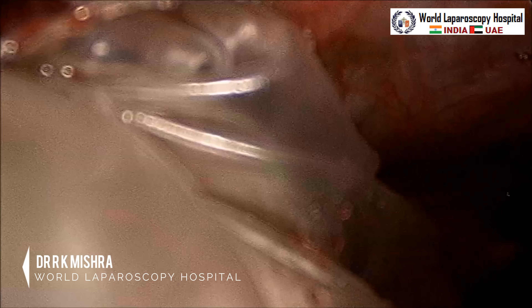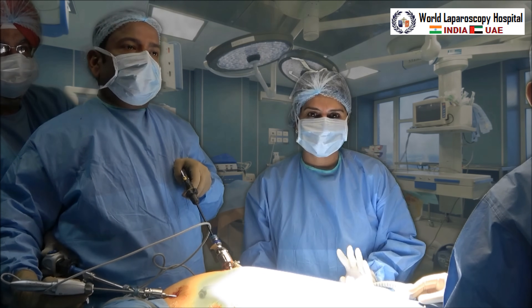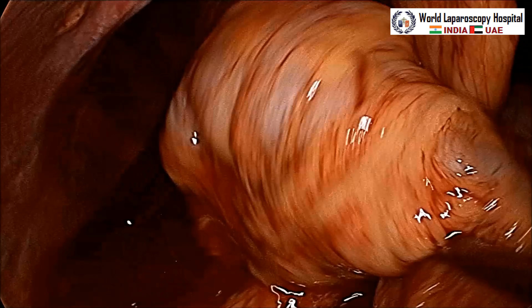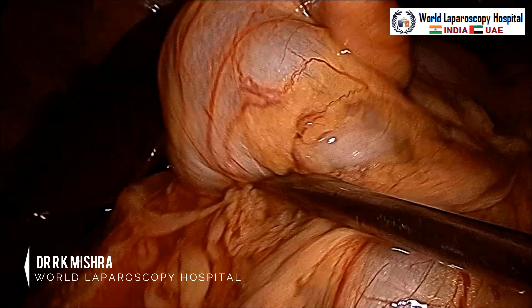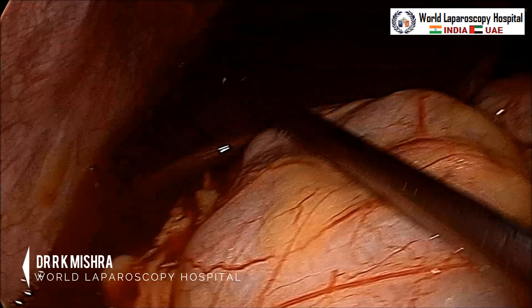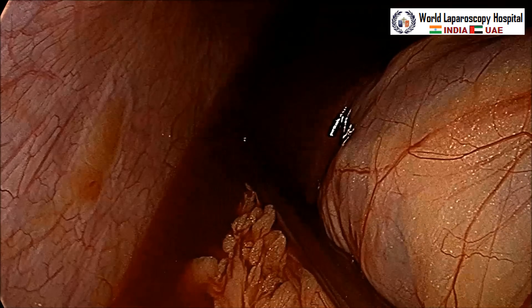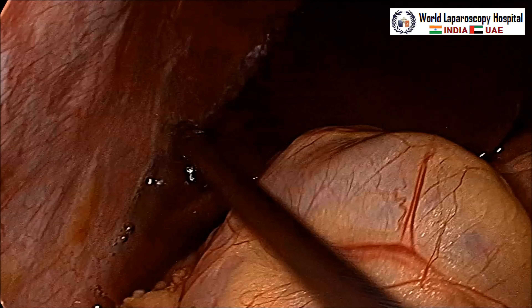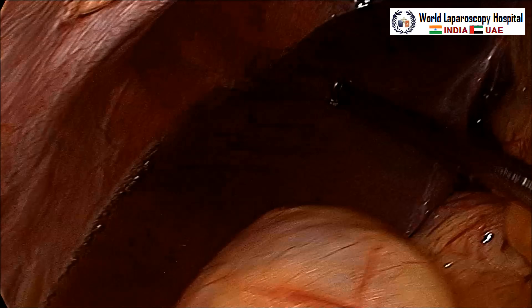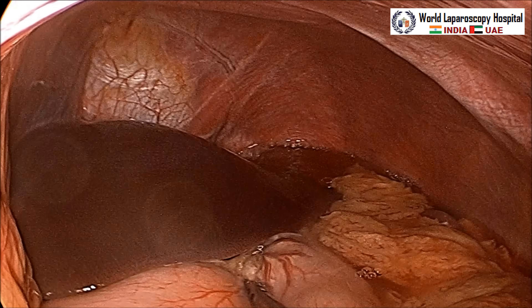Slowly check it out. Once the specimen is out, inspect the entire pelvis. Then put the patient's head further down and perform lavage of the upper abdomen. Morrison's pouch has a lot of blood collected because throughout the surgery the patient's head was down. Blood collected in the diaphragmatic area, Morrison's pouch, and splenic fossa must all be washed out. If you do not wash these areas, postoperatively there is a chance of subdiaphragmatic abscess, as blood is an irritant and can act as a culture medium for bacterial growth.